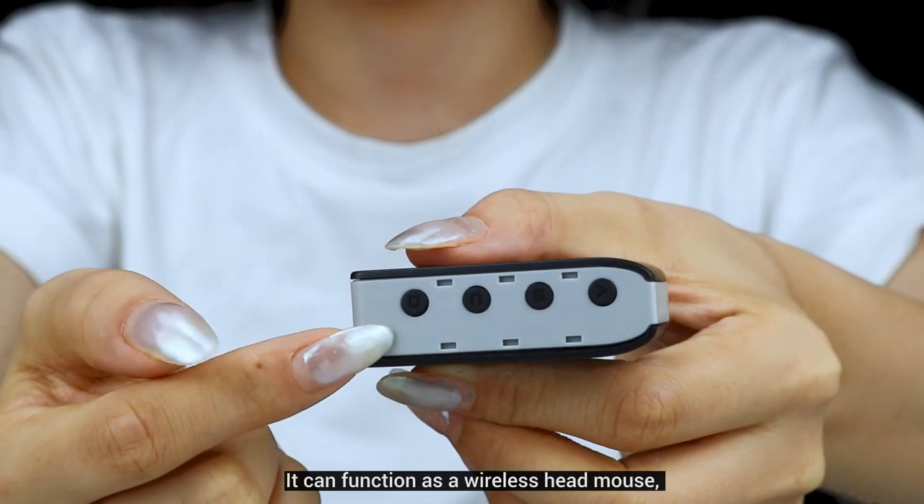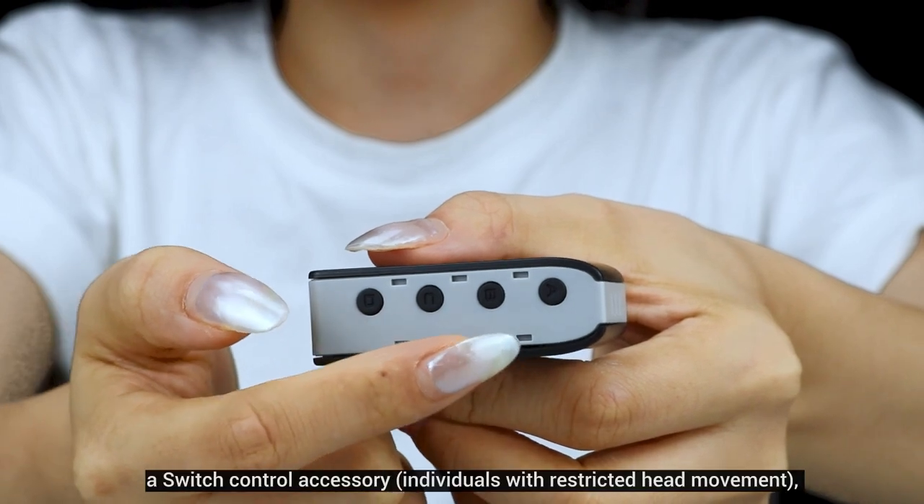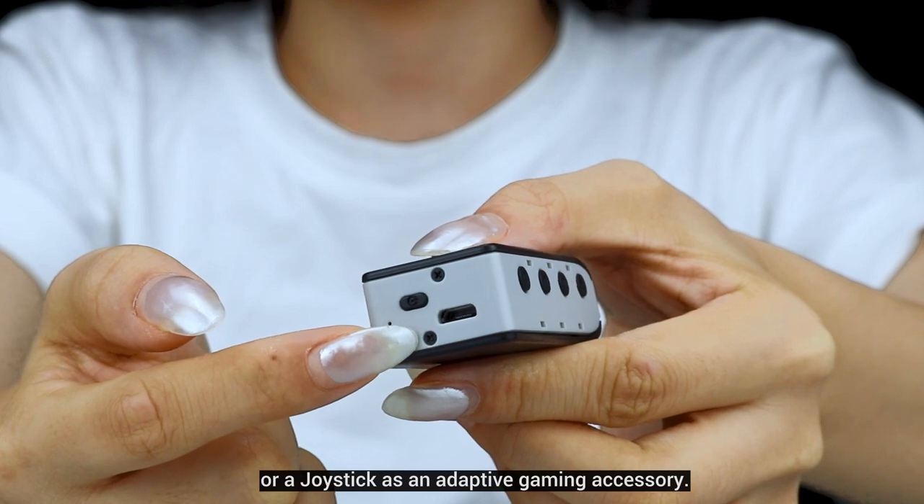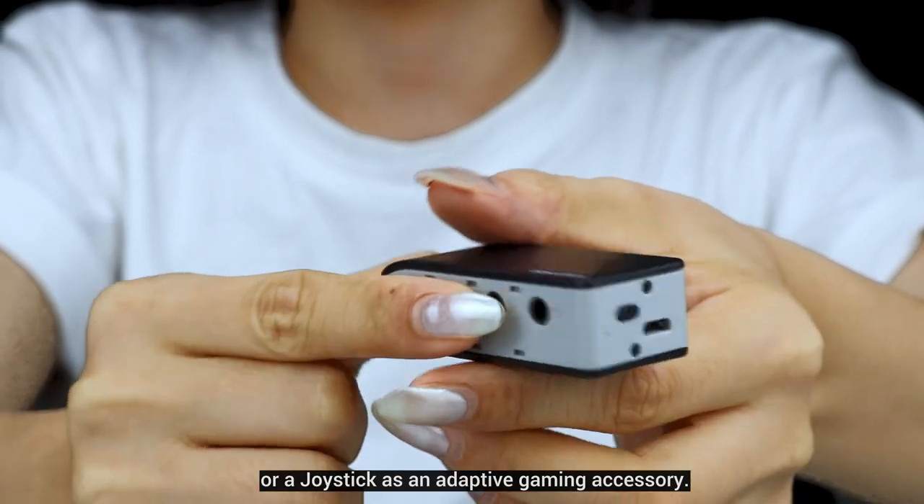It can function as a wireless head mouse, a switch control accessory for individuals with restricted head movement, or a joystick as an adaptive gaming accessory.